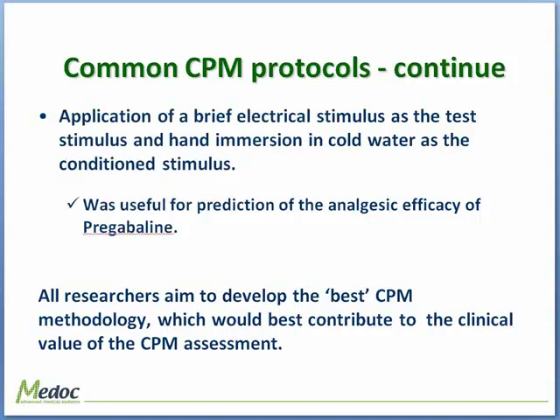You can place a thermode or any other pain stimulus on different body sides. It's also a question whether there is a preferable body area for CPM. Maybe if I use the same protocol on different body areas, I would get even better results, say if I put it on a leg and not on the forearm. But this is what we have so far. The most popular sites are still the hands and arms, with hot and cold water.